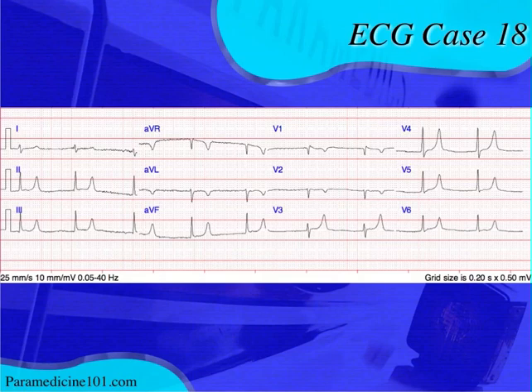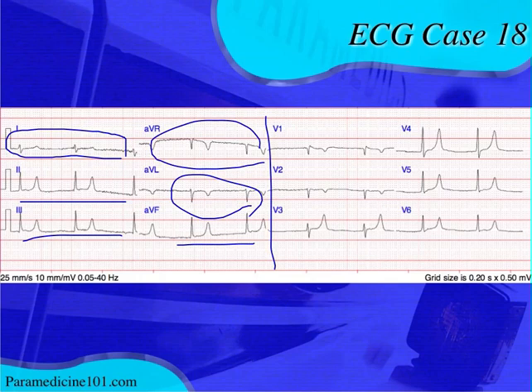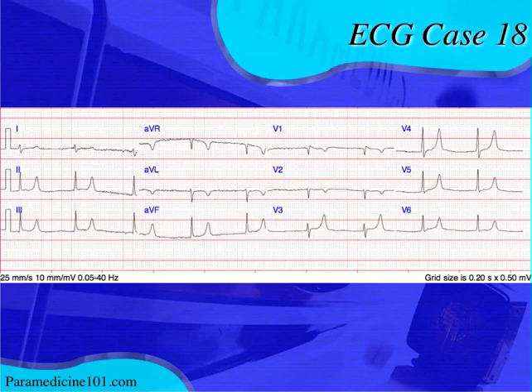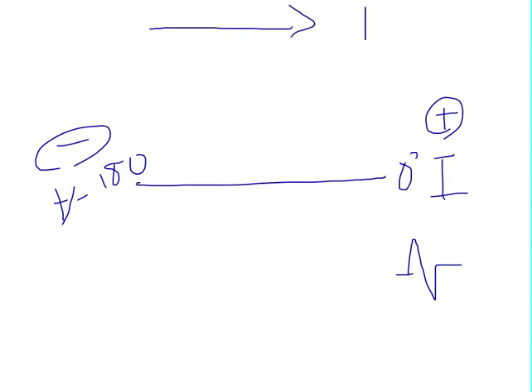After rate and rhythm, you want to look at the QRS axis — the frontal plane axis. You can see that lead I is biphasic, but leads II and III are both positive. AVF is also positive, AVL is negative as it often is, AVR is negative as it should be. If lead I is biphasic — lead I has its positive electrode on one side (0 degrees) and negative on the other (±180 degrees) — if lead I is equal-phasic, meaning it's just as positive as it is negative, think about what gives you that. When the mean axis is perpendicular to a lead, you get an equal-phasic QRS complex.